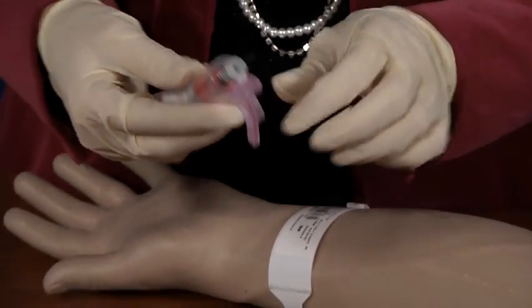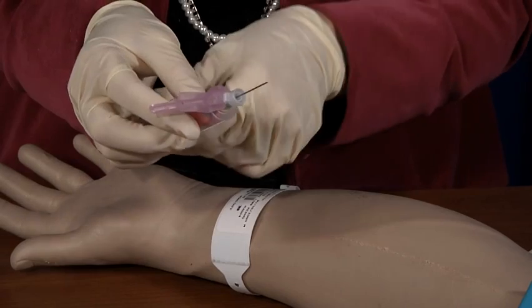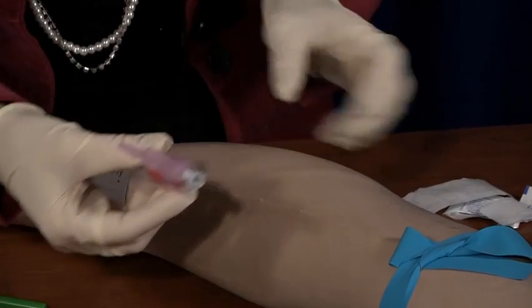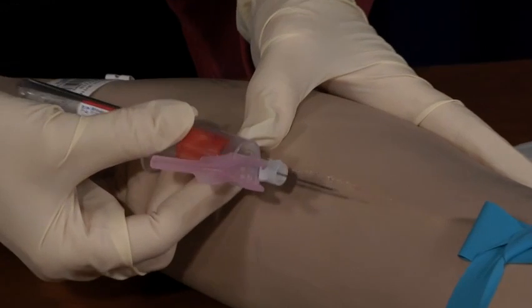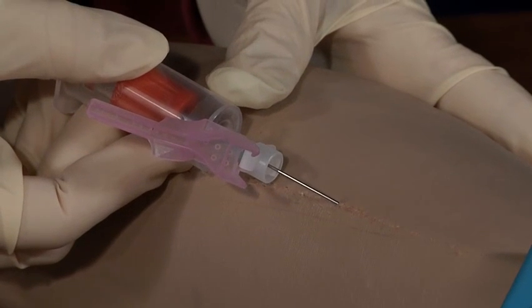Remove the top. Push that down. This is also another safety device. When we get finished, we will lock this safety device over our needle. We're going to use bevel up. We're going to put traction on the vein. We're going to go in at about a 30 degree, right over the vein, and you'll feel a pop when you get in.